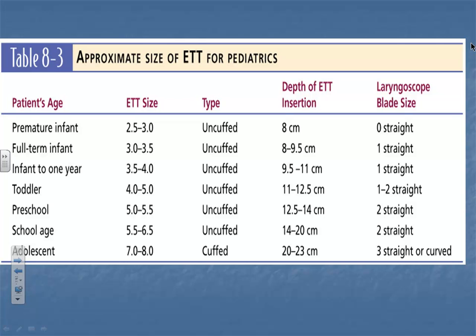Okay, y'all make sure you know that too. I don't know if this is in your book. Something like this is probably in your books. What do you see in common over here for blade size? They're all straight.